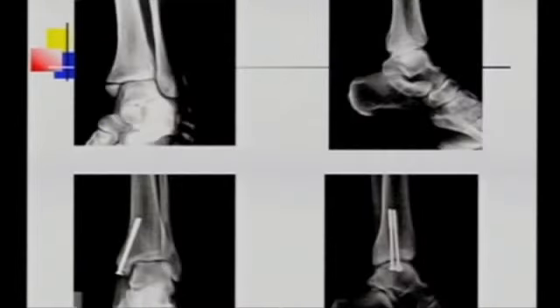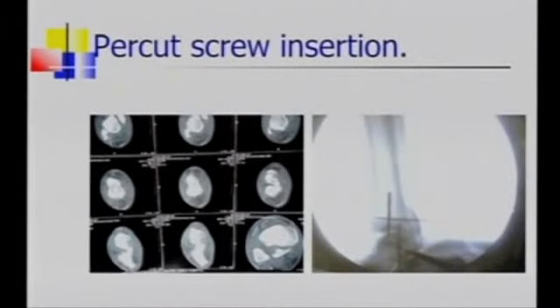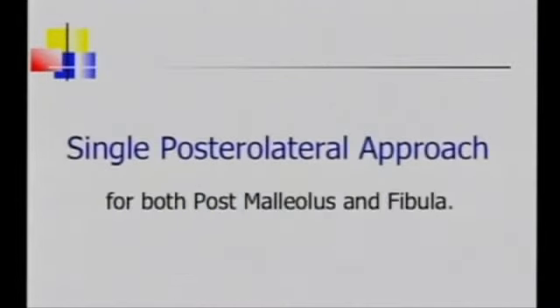Look at this, it was reduced nicely, but this is again my own case, treated like this. See this, the medial impaction was missed by me. So if you miss the medial impaction, again the joint is not going to be good. So pay attention to this reduction. This is how medial impaction is to be noted preoperatively. And if you are using a percutaneous screw, again be careful, because only on radiology you may miss it.